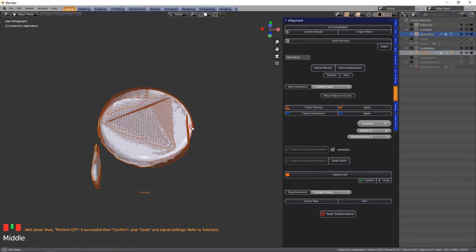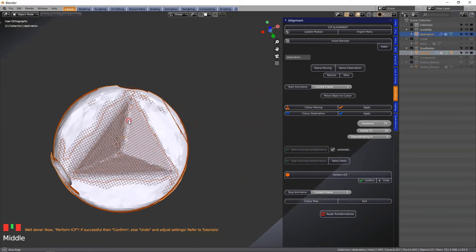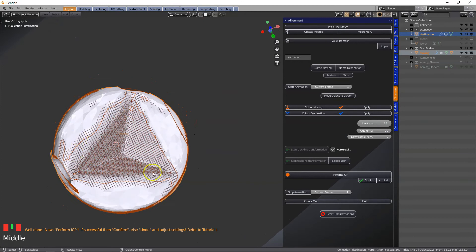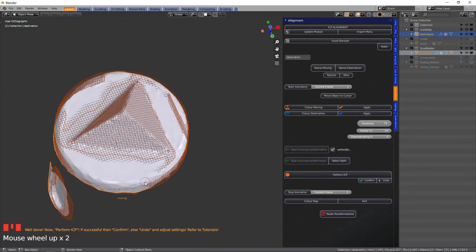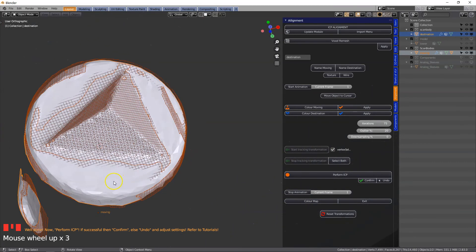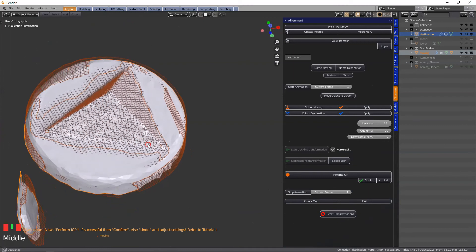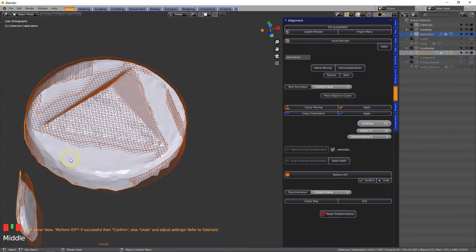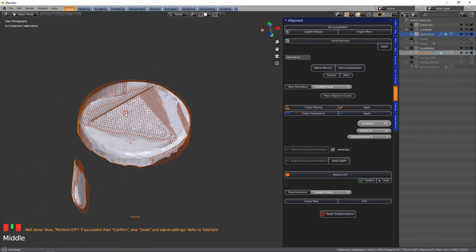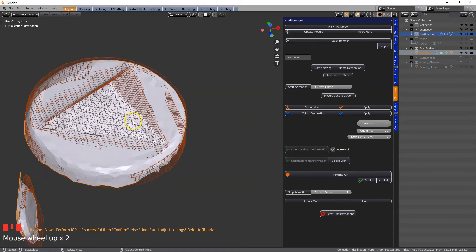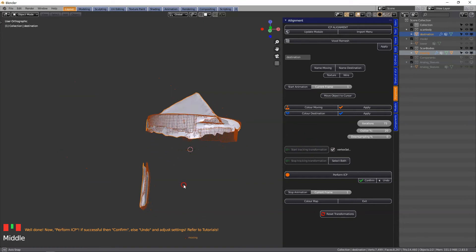Then just check that you've got a good connection. You'll never get an exact 100% overlap because the scan itself is not as accurate as the scan body. The finer your scanner is, the better you're going to get an alignment.